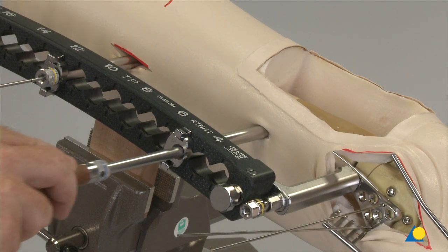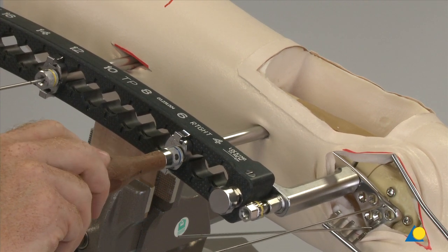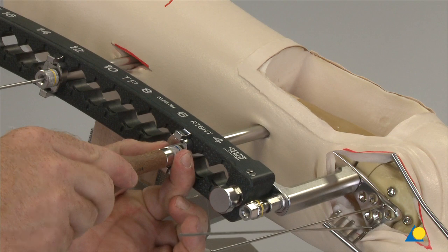Attach the handle to the drill guide. Insert it through the guide sleeve and thread it into the plate hole. Remove the handle.